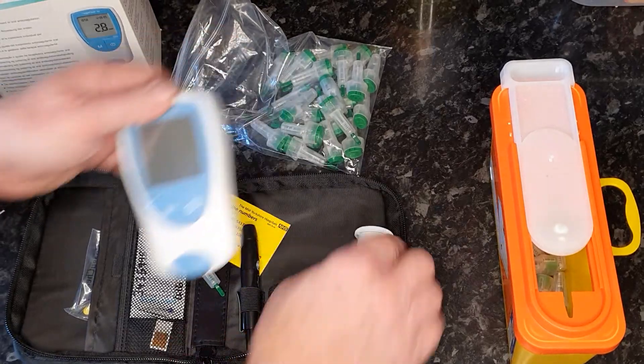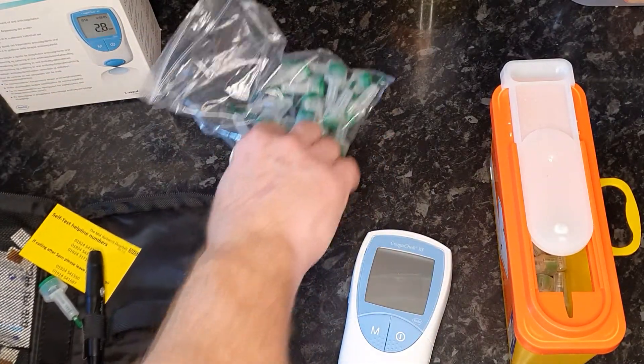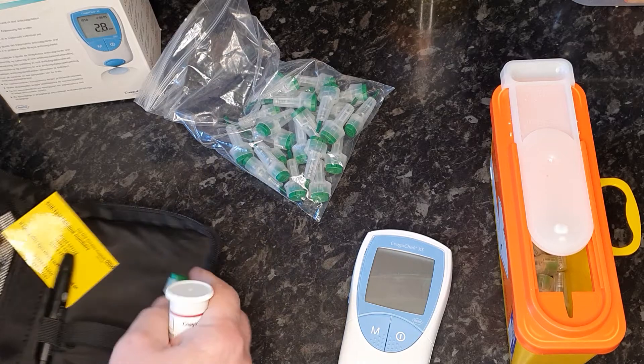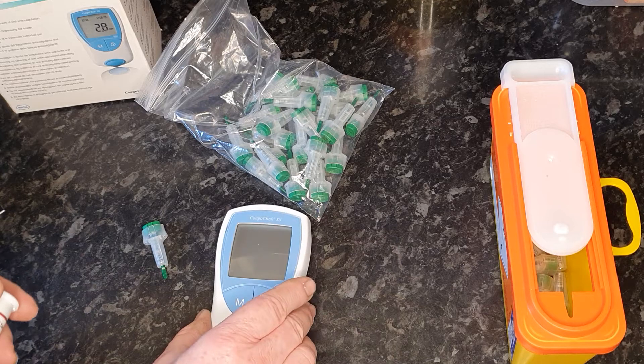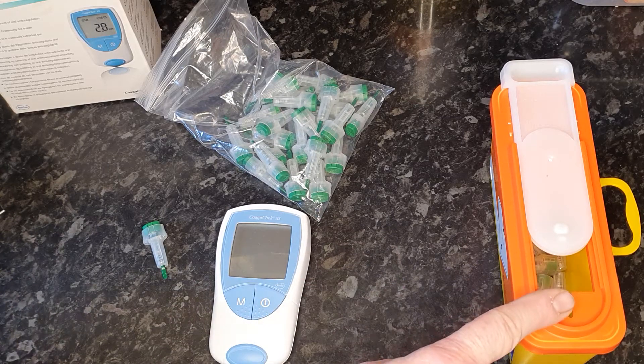You get the machine, stabbers — as I call them — finger pricks, and a set of test strips. When you use the machine, you also need a clinical waste container.